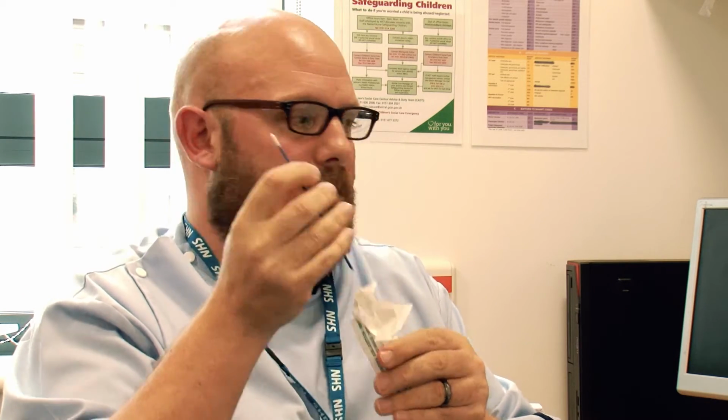So it's just this one swab. It's the same as before really, which I've just shown you with the vaginal swab. So lid off, test to one side, be careful not to spill the liquid. Swab like before, cotton bud.